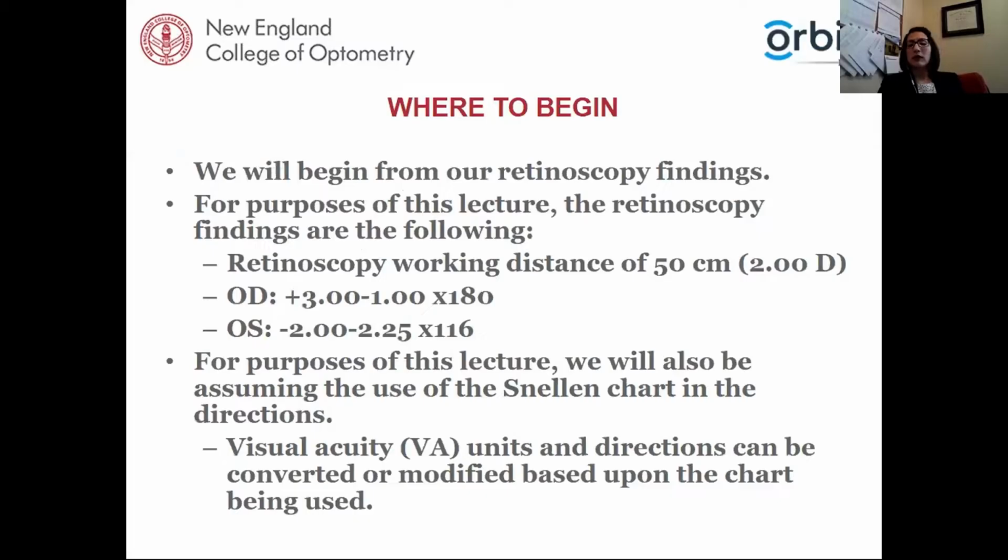So we will be starting from our retinoscopy findings for the procedure today, but you can modify this a little bit if you have autorefraction or lensometry findings by either just starting exactly from those findings, or you can add maybe a half diopter, less minus, or more plus to start if you're worried about giving the patient too strong of a prescription. But we will be starting from the retinoscopy findings.